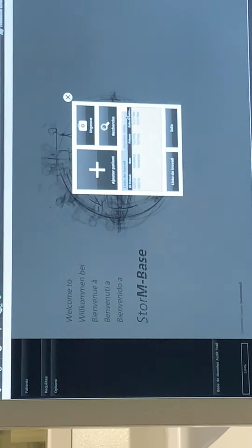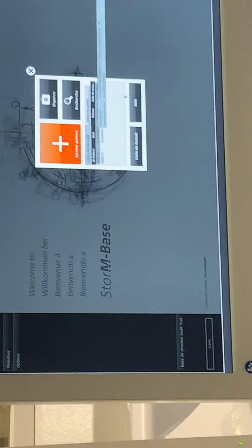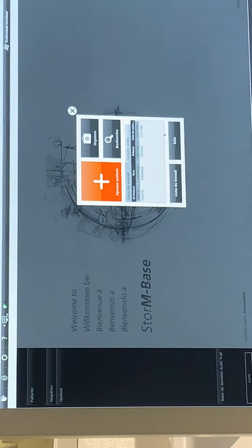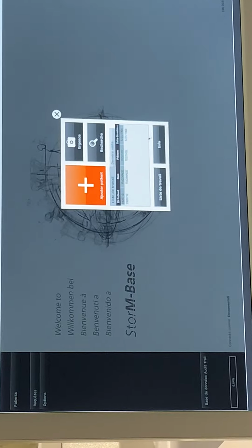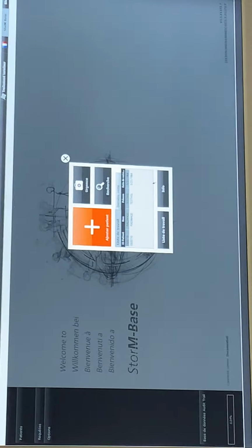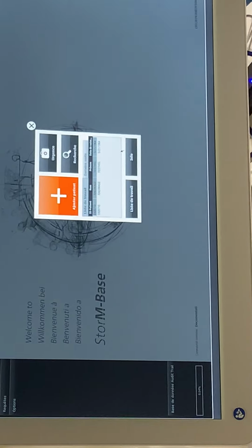Okay. You can choose the patient by one mouse click and then you will see something orange. The orange button means book a patient. And we always need to book a patient because we want to have our database in there. So please, I would like to ask you to press book patient.